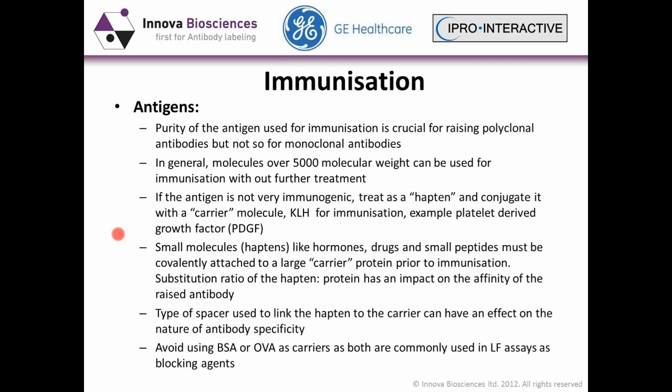For small molecules, it is important that the molecules are coupled covalently to a carrier protein. Otherwise, you won't get any immune response to the small molecules. And in this case, it's very important to look at the ratio of hapten to proteins, because that could have an impact on the affinity of the antibody raised. And many of the rules involved here, or protocols, are very empirical. There's no set rules as such, and quite often you need to do it by trial and error.